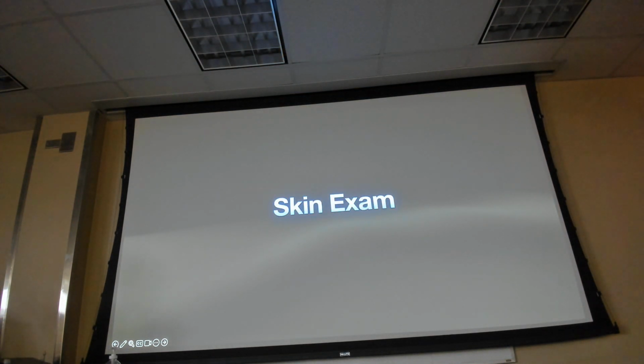So skin exam. What are some indications for bedside ultrasound to evaluate skin? We talked about this a little bit when we talked about DVT. What are some other things we can do to assess? You got a red hot leg. What are some other things? Infection, right? So cobblestoning. So here we got this patient with a red hot swollen leg.